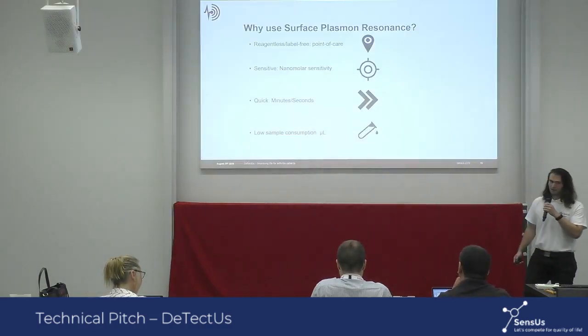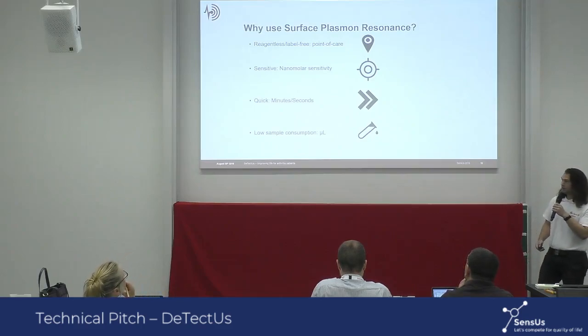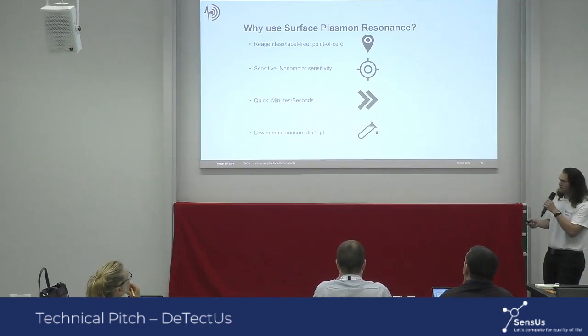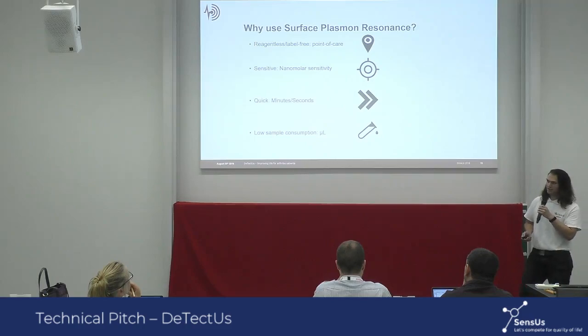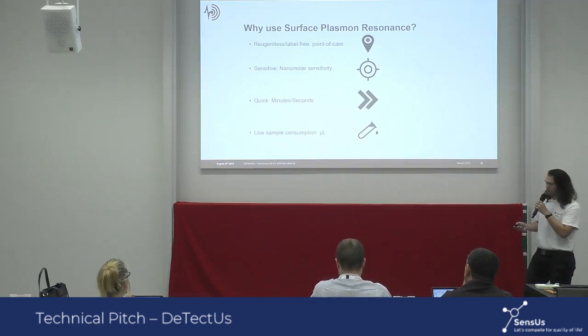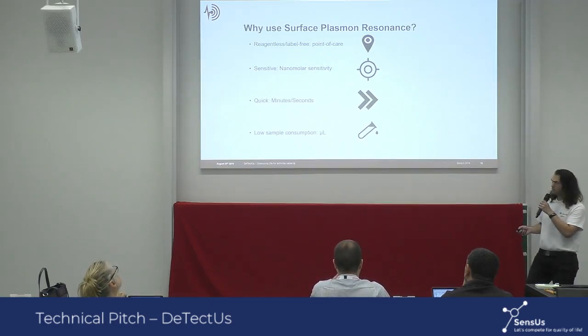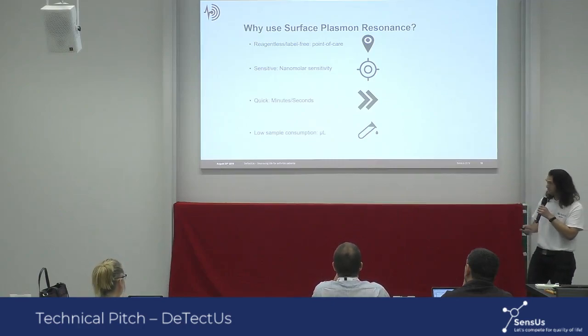So why use surface plasmon resonance? It is a label-free technique that requires no sample preparation and is thus suited for easy point-of-care diagnostics. It is sensitive in the nanomolar range, and that is the clinically relevant range for therapeutic drug monitoring of adalimumab. It is quick in assay time, taking seconds to minutes, and requires only a few microliters of sample.